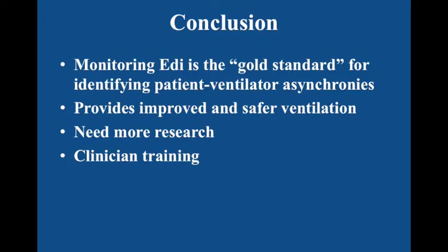But we still need to do more research on this new mode because we're not used to using it clinically, so we lack clinical experience. As for me, I have never used it clinically, so I put clinical training here to remind everyone.